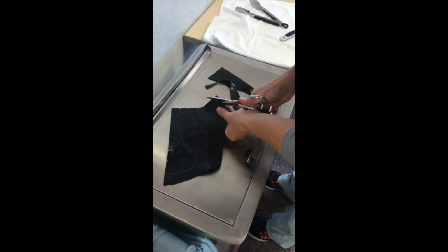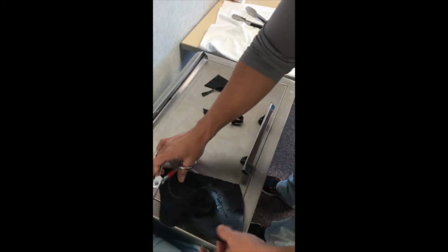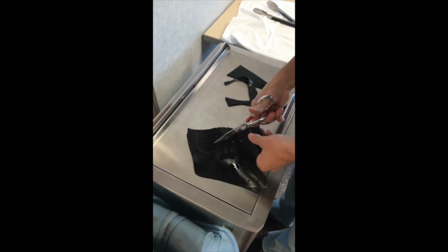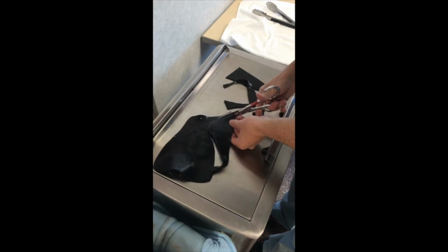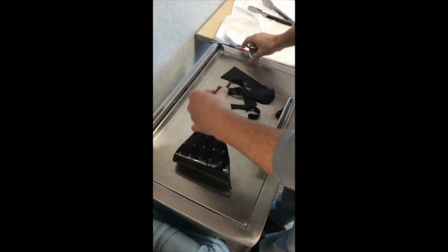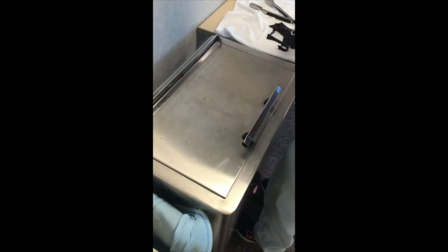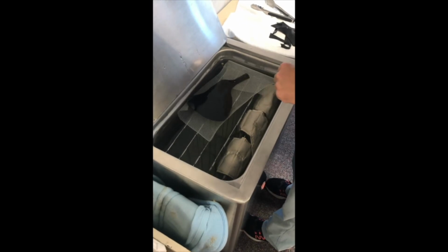Okay, so all I'm doing, you want to be very careful how you handle the material so we don't overstretch it. Again, if it has rebound, it will stretch back, but we don't want to overstretch the material. And all we're doing, after we cut it, again, we're going to lay it back down on the hydrocollator.